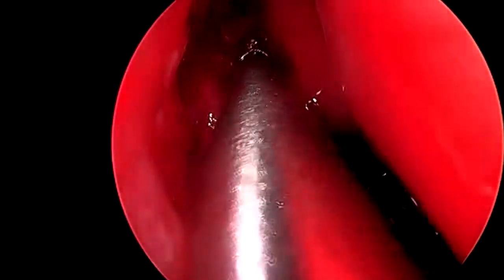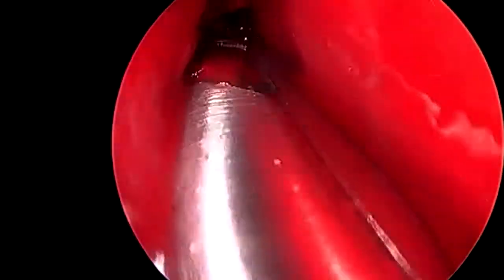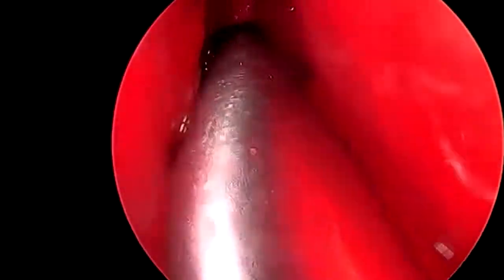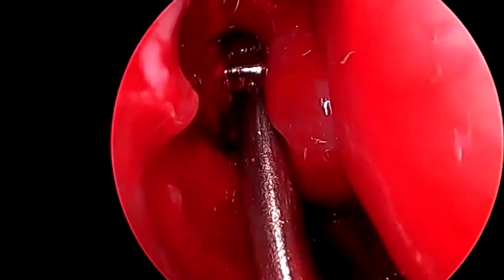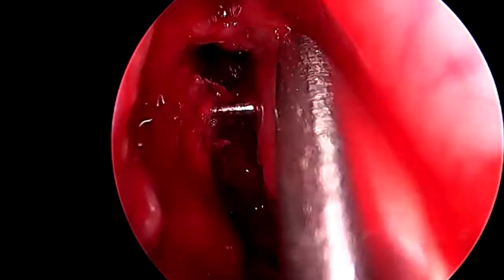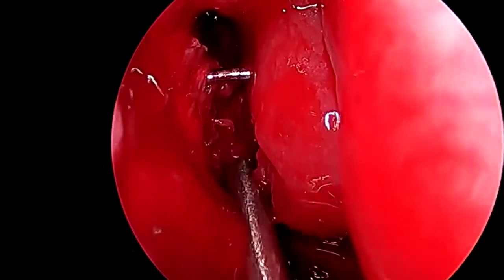Additional scar tissue and bone is removed in the area until the probe is noted to be freely coming out of the common canaliculus without any evidence of obstruction.